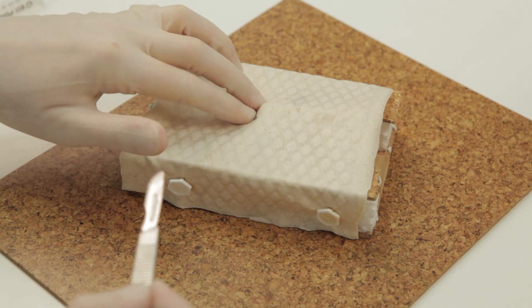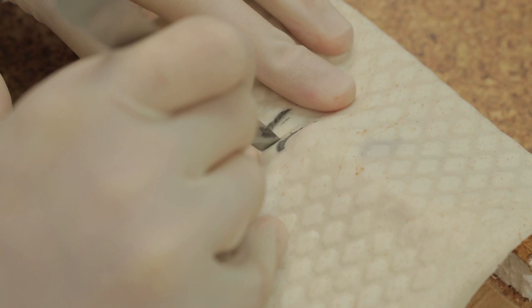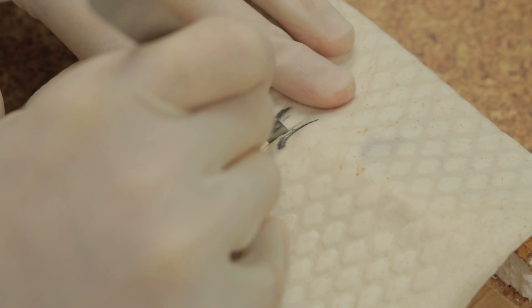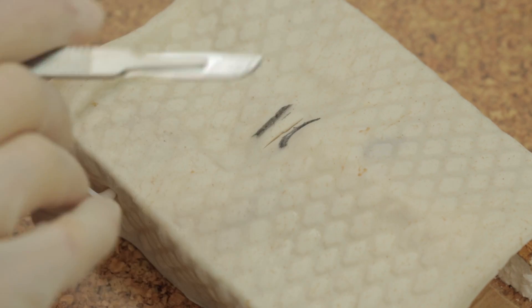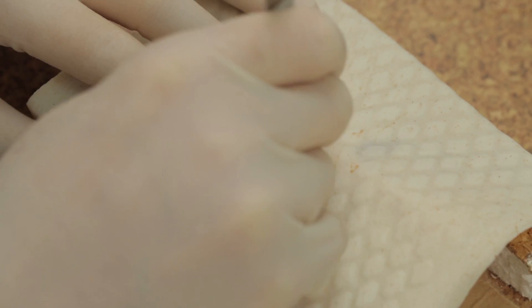For an emergency tracheostomy, incise the cricothyroid membrane using a scalpel blade. Using the handle of the scalpel in a rotatory motion, widen this incision.